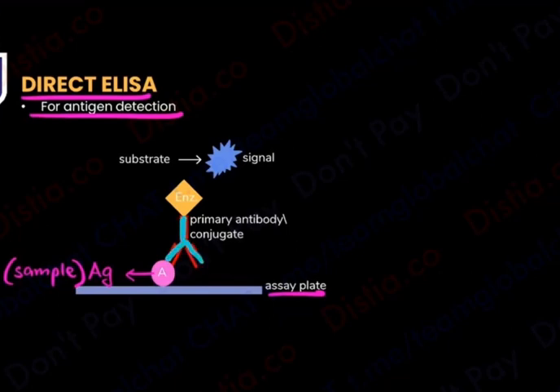You know what I'll do? Smartness that I'll do. I will combine that antibody with an enzyme. Which enzyme are we dealing with? Horseradish peroxidase. So for example, let's assume the patient had the antigen. If I add an antibody with an enzyme, will an antigen-antibody reaction occur? Yes, an antigen-antibody reaction will happen. How will I get to know? You say, ma'am, add the substrate for this enzyme, that is H2O2. This enzyme will then go and break the substrate, add some color. You add benzidine and you will get a positive color.